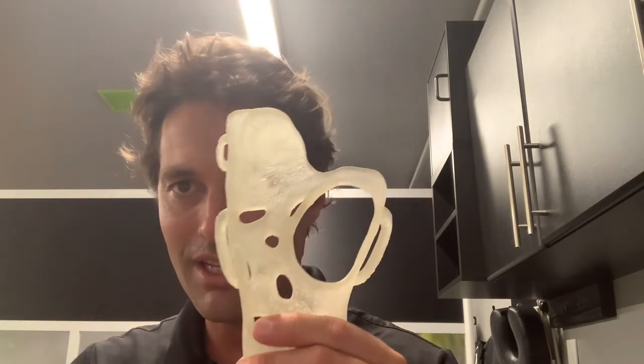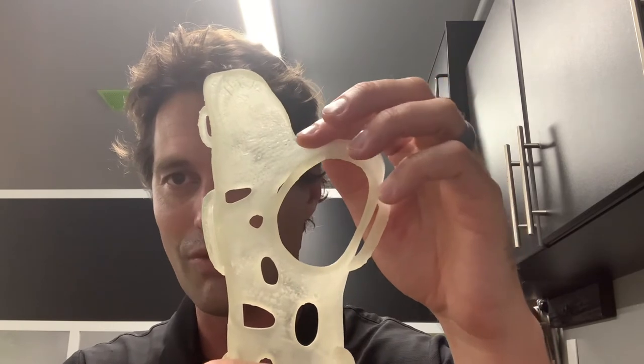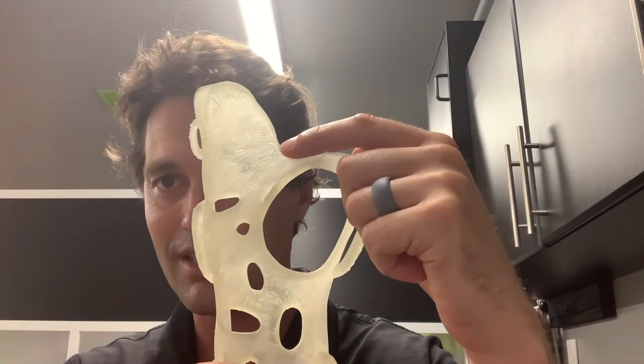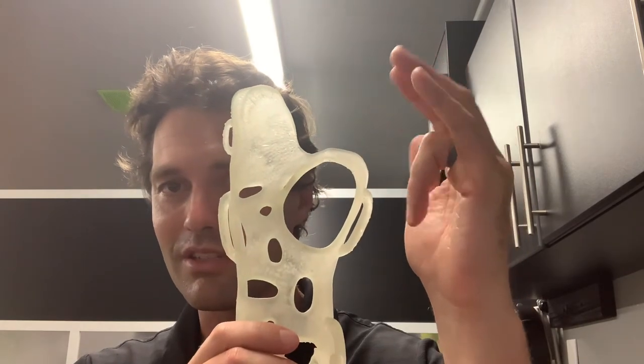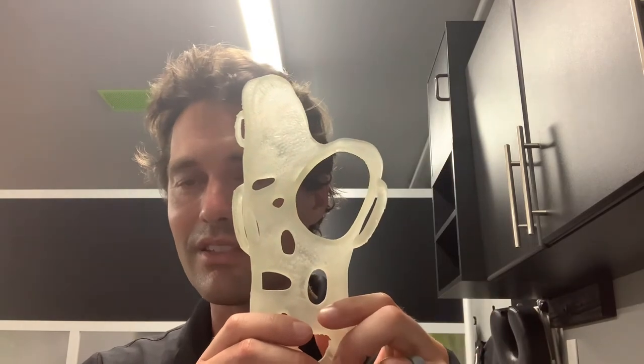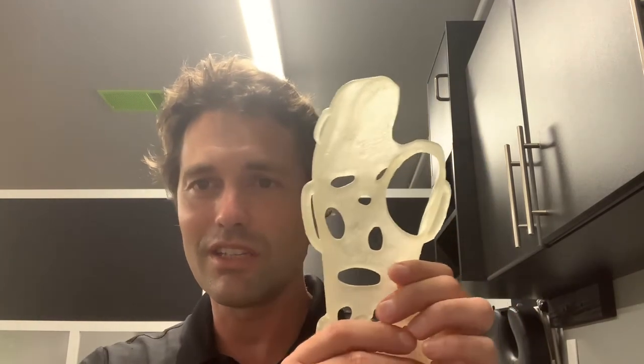The other change I made is right here in this notch for the third finger. That was straight across and it was just inhibiting a little bit of flexion there, so I just shaved that down — same process, really easy. I used a Dremel bit to fit in there.